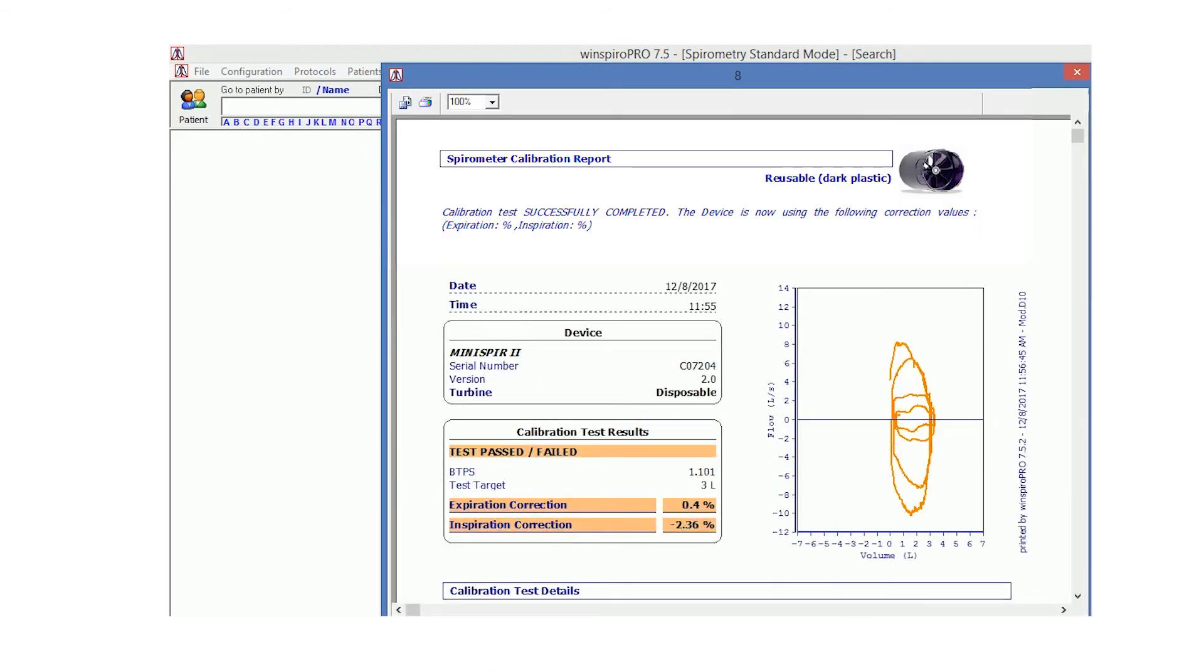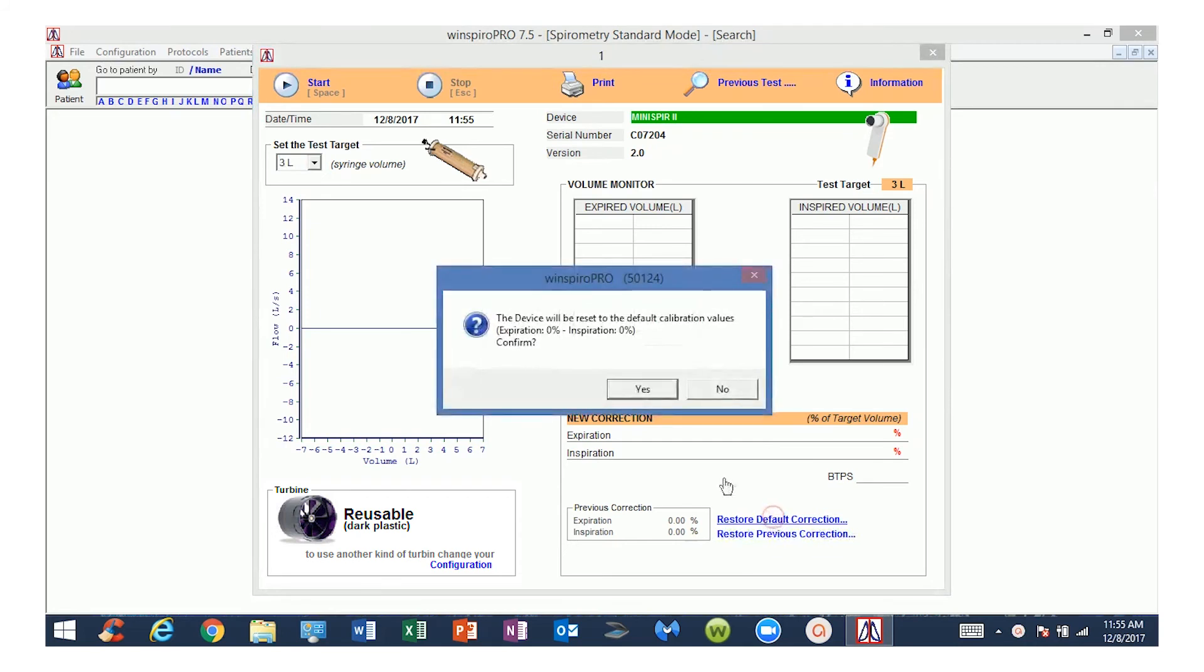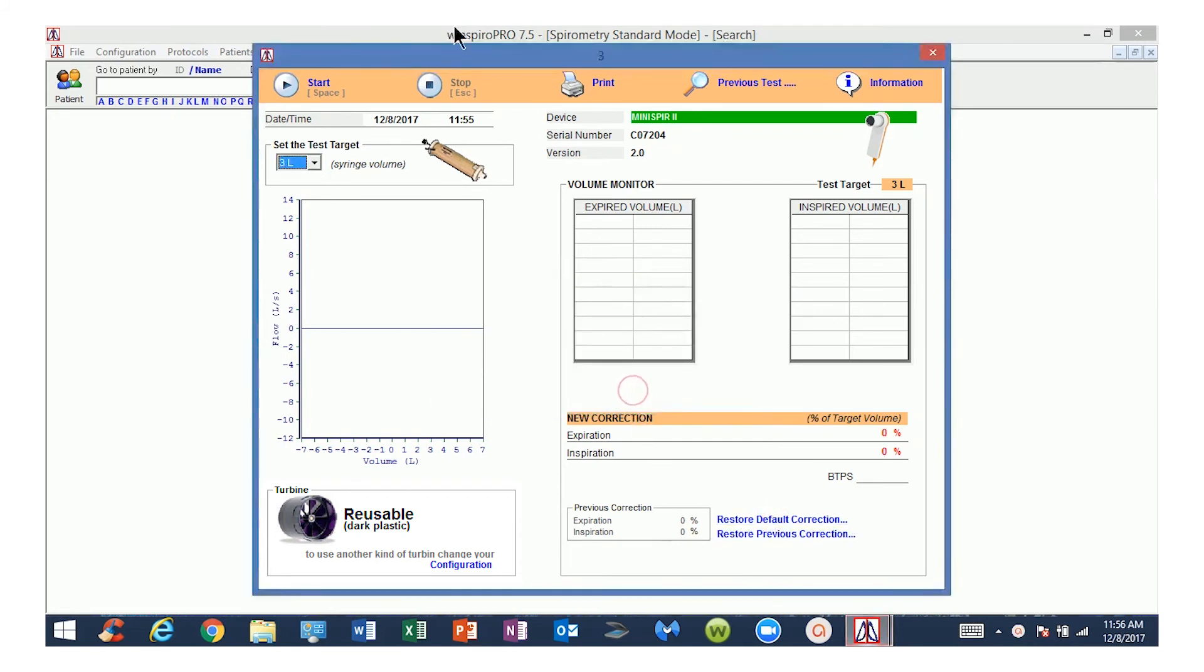If the results are outside the plus or minus three percent range, then repeat the test for a second time by resetting to default correction and starting the test again.